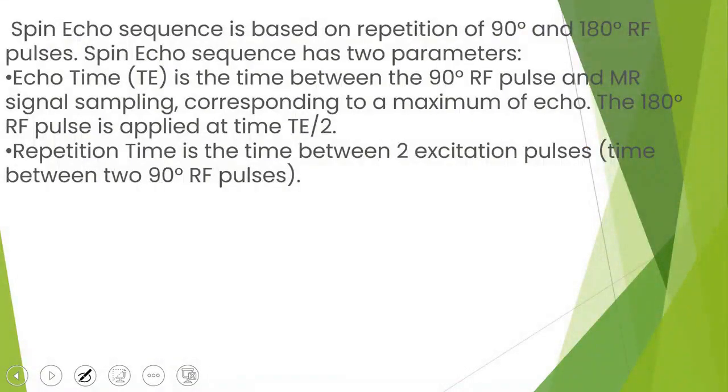In the gradient echo, I am not concerned with having a refocusing pulse present. Rather, I want to work on the concept of this idea, which is fundamental to understanding the broader implications and applications.